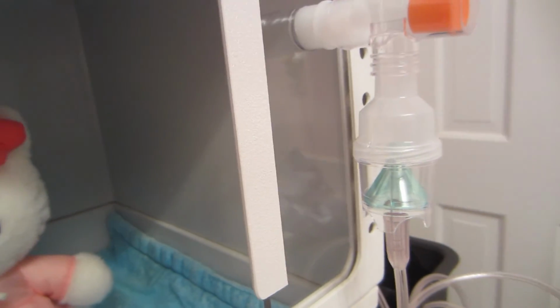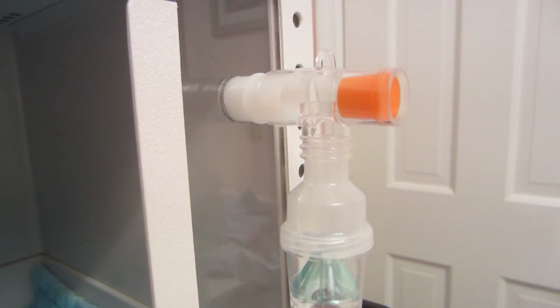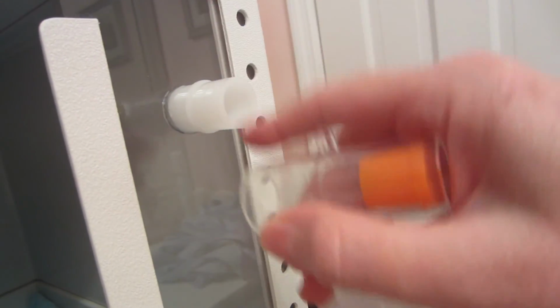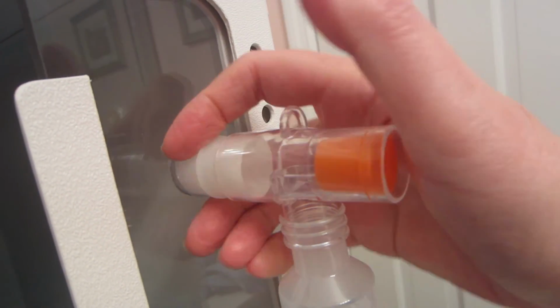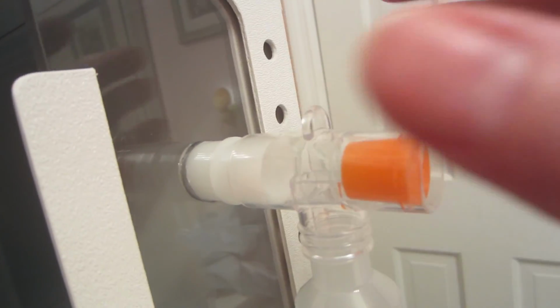So that's about it. I think it's pretty simple. You don't need any fancy hoses and crazy stuff. It's just this basic nebulizing unit here and your compressor. And you're just going to need to drill a hole in whatever storage box you're using, if that's how you go, so that that will stick into the chamber, and you can put some duct tape around it, something to secure it, or you can just stand there and hold it if you want.